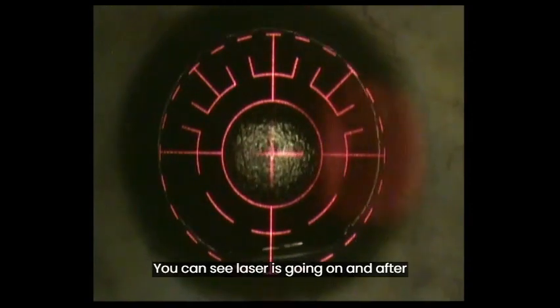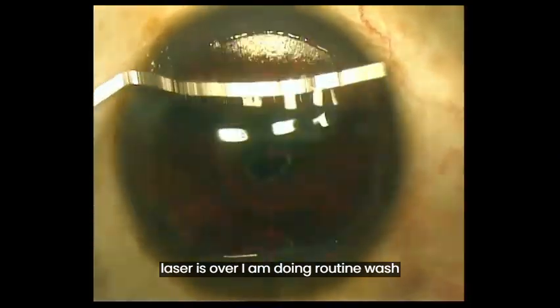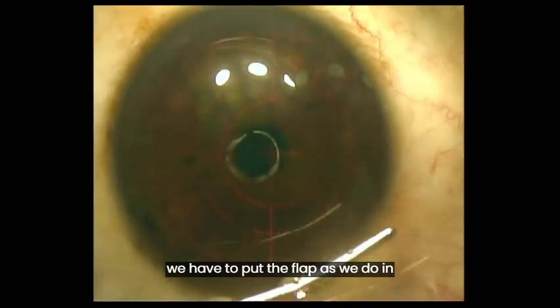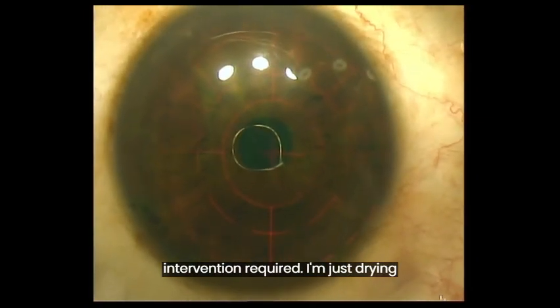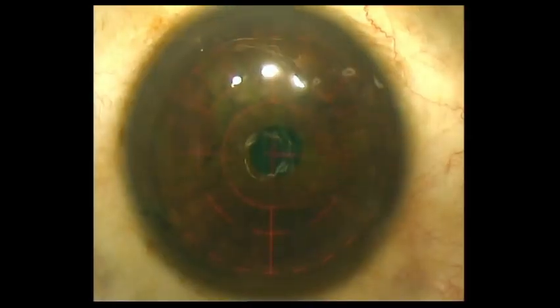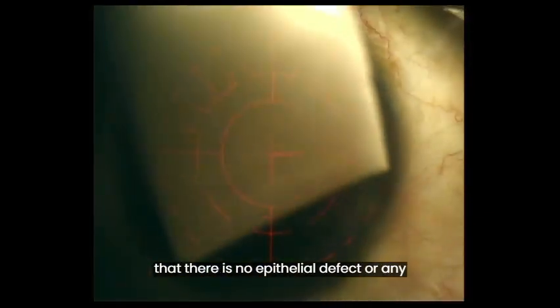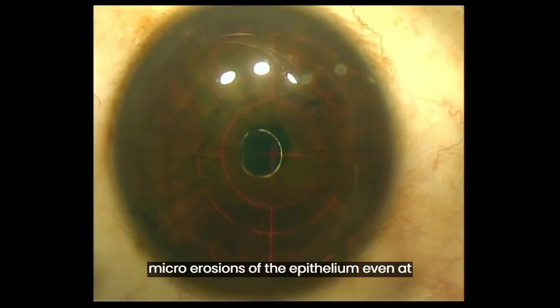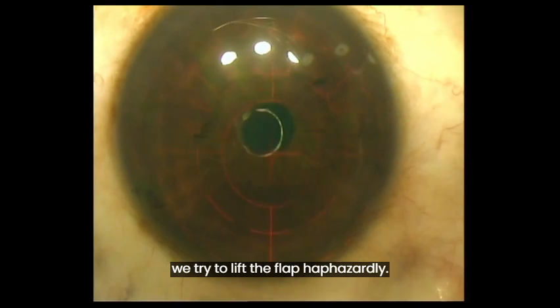You can see the laser is going on, and after laser is over I am doing routine wash of the bed. After washing the bed, we put the flap back as we do in routine LASIK — no special intervention is required. I am just drying the flap with merocel sponges, ensuring that the flap edges are well opposed. You can notice here that there is no epithelial defect or even micro erosions of the epithelium at the flap edges, which generally happens if we try to lift the flap haphazardly.